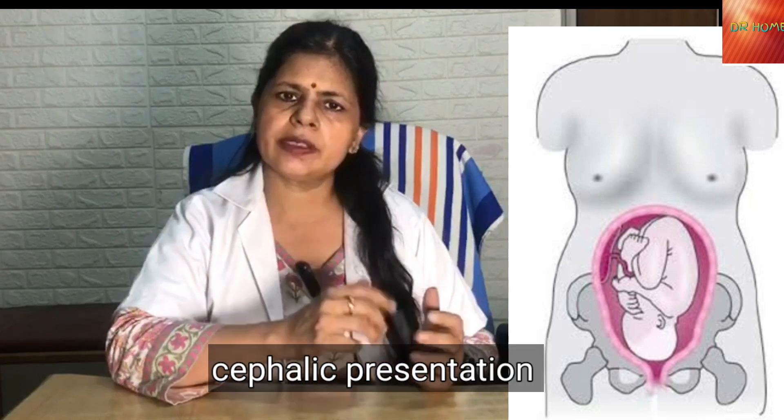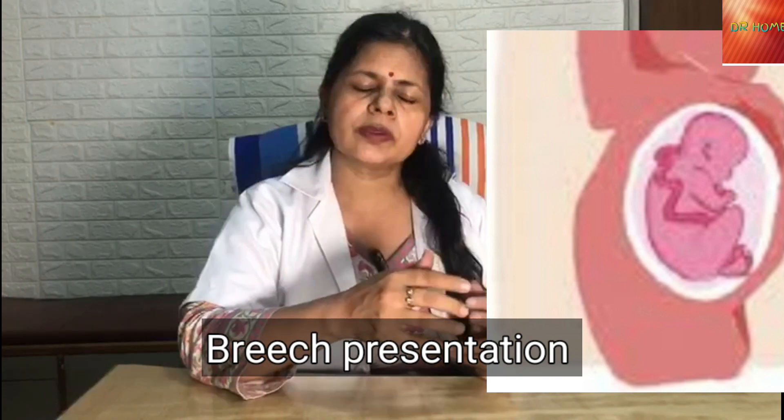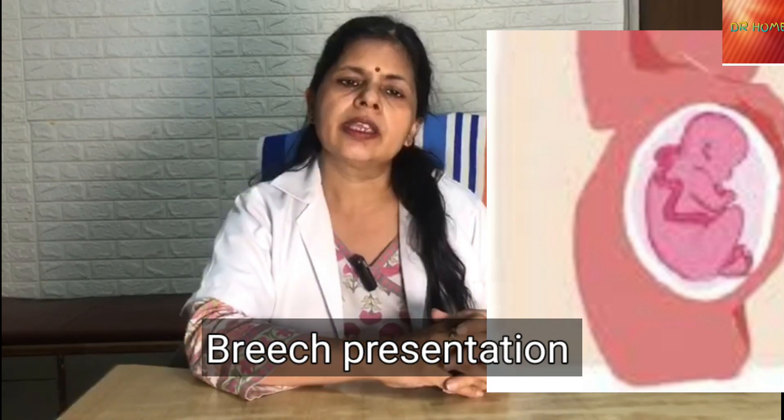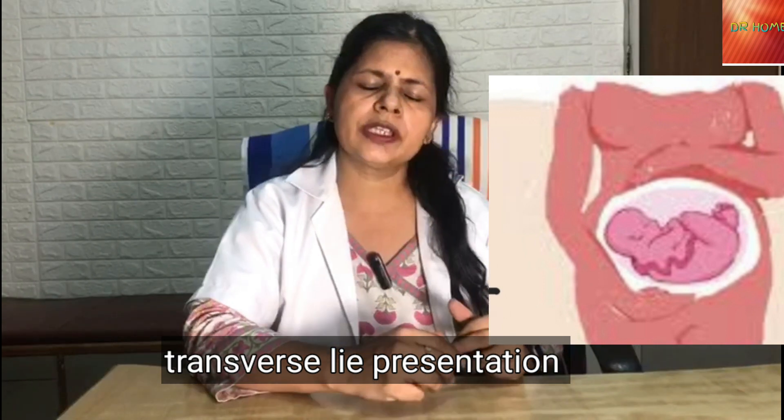In the growth scan we also see the baby's position. If the baby's head is lower, we call it cephalic presentation, and normal delivery chances are good in this condition. If the baby's head is upper and the baby's buttocks are lower, we call it breech presentation. There is also a third position called transverse lie, where the baby lies sideways. In breech presentation and transverse lie, normal delivery can be a problem.